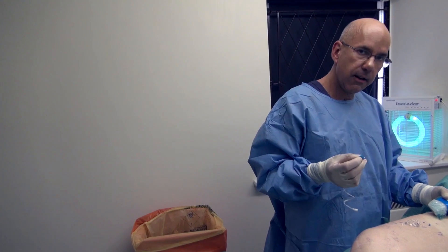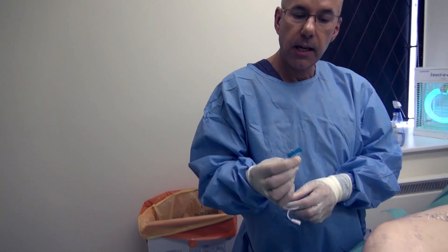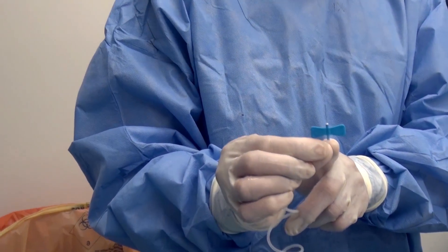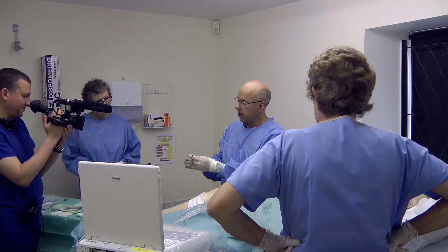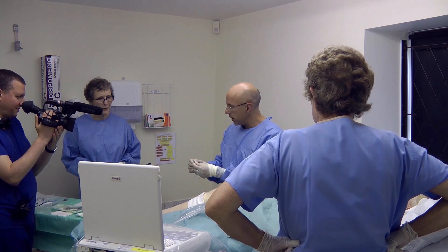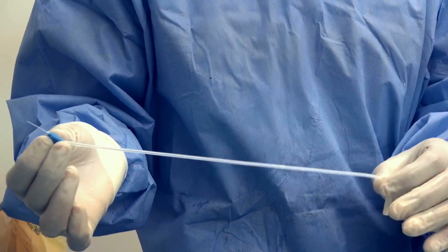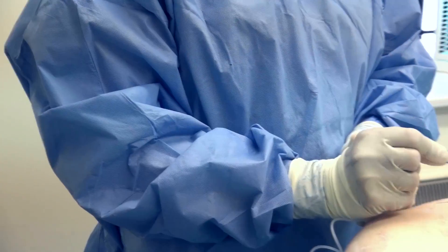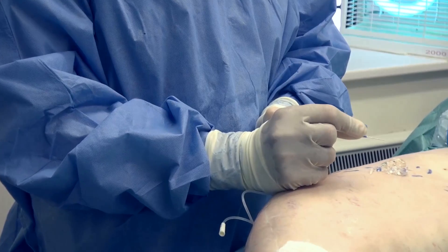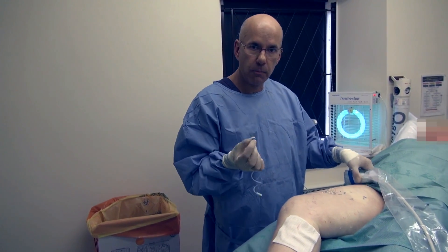I'm going to do the foam sclerotherapy now, and I like to use a blue butterfly cannula. It's called a butterfly cannula because it has a passing resemblance to a butterfly, and it is blue — which means it's a 23 gauge cannula. It has a piece of transparent tubing which allows me to see that I've cannulated. The butterfly wings allow me to use very delicate movements, as if writing with a pen, making it very easy to cannulate small veins.